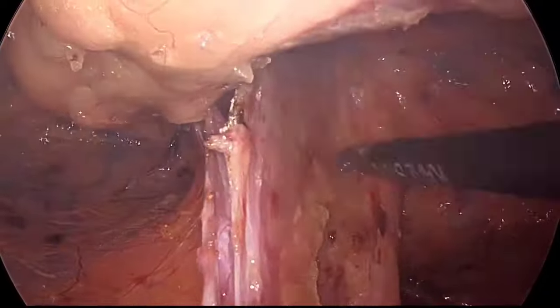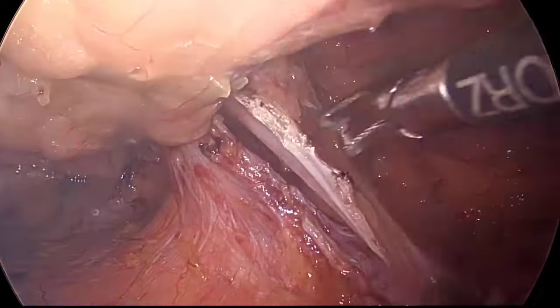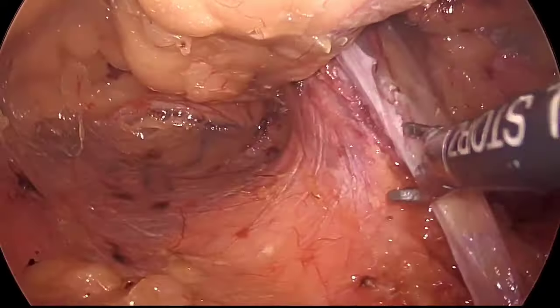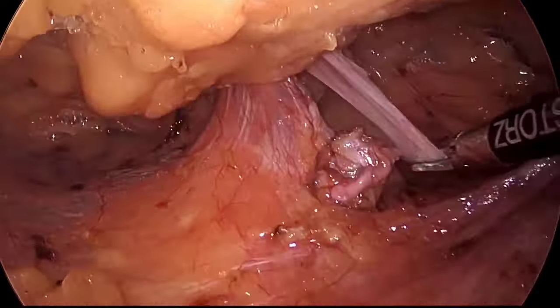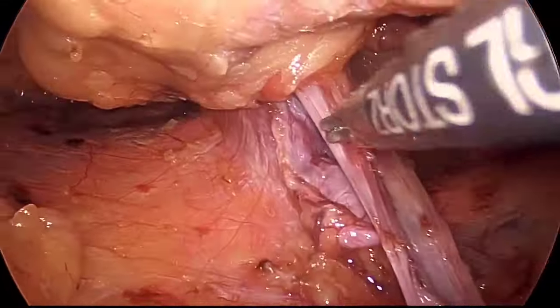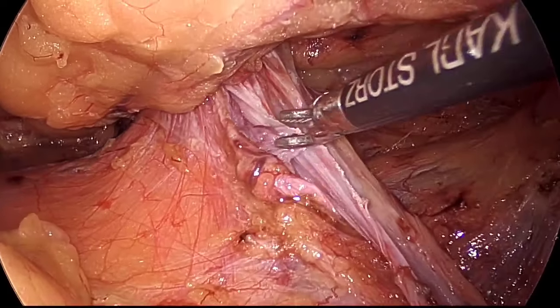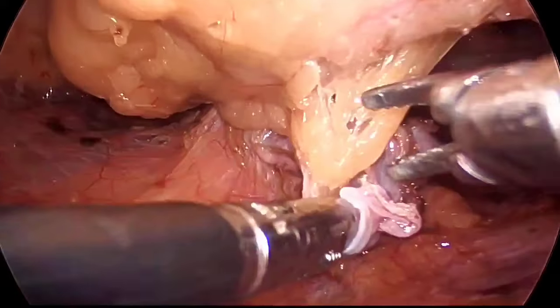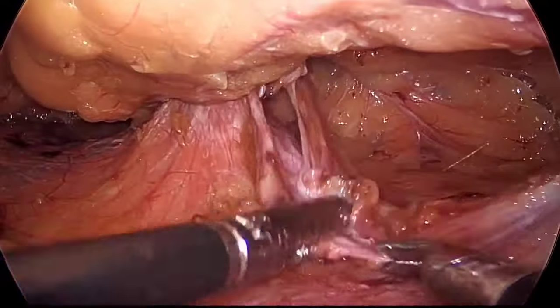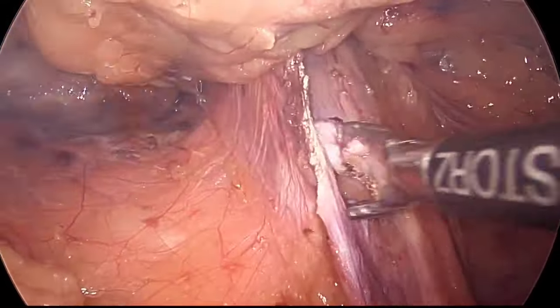But you can see the inside of the peritoneal cavity, now the bowel. So while dividing, you have to take care of the intra-abdominal contents, so that no transmission of energy is done onto the bowel or bladder. So a little bit of division of the sac, and then a dissection to identify the proper plane of division, and then gradually the circumferential, the 360-degree division should be done.